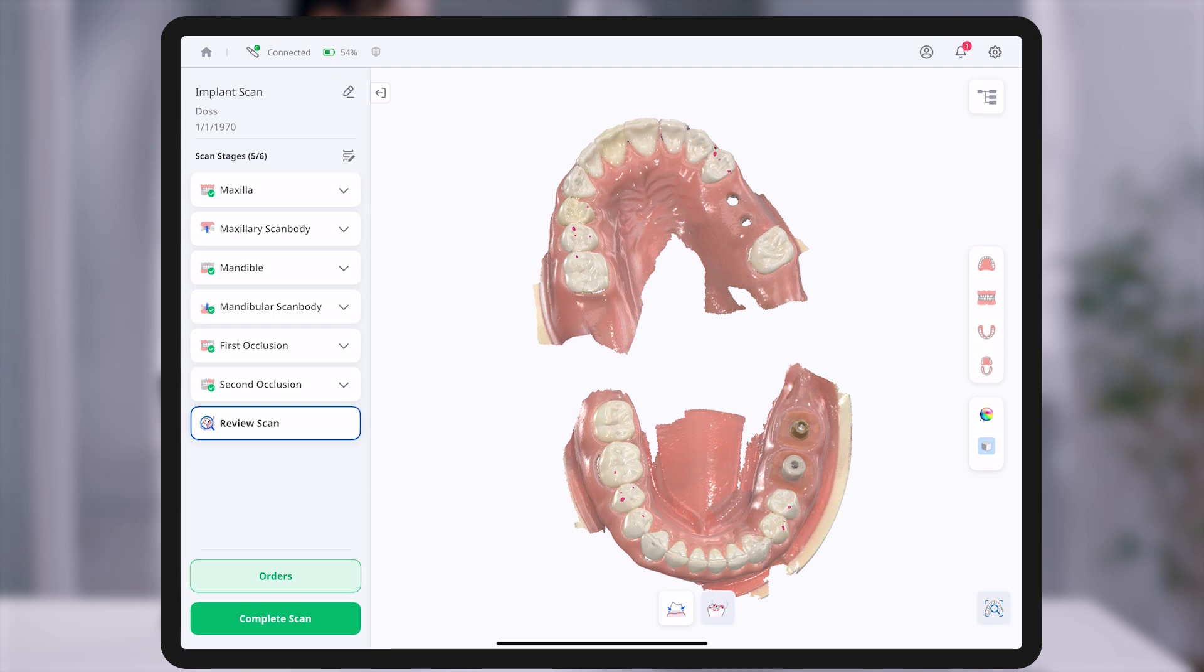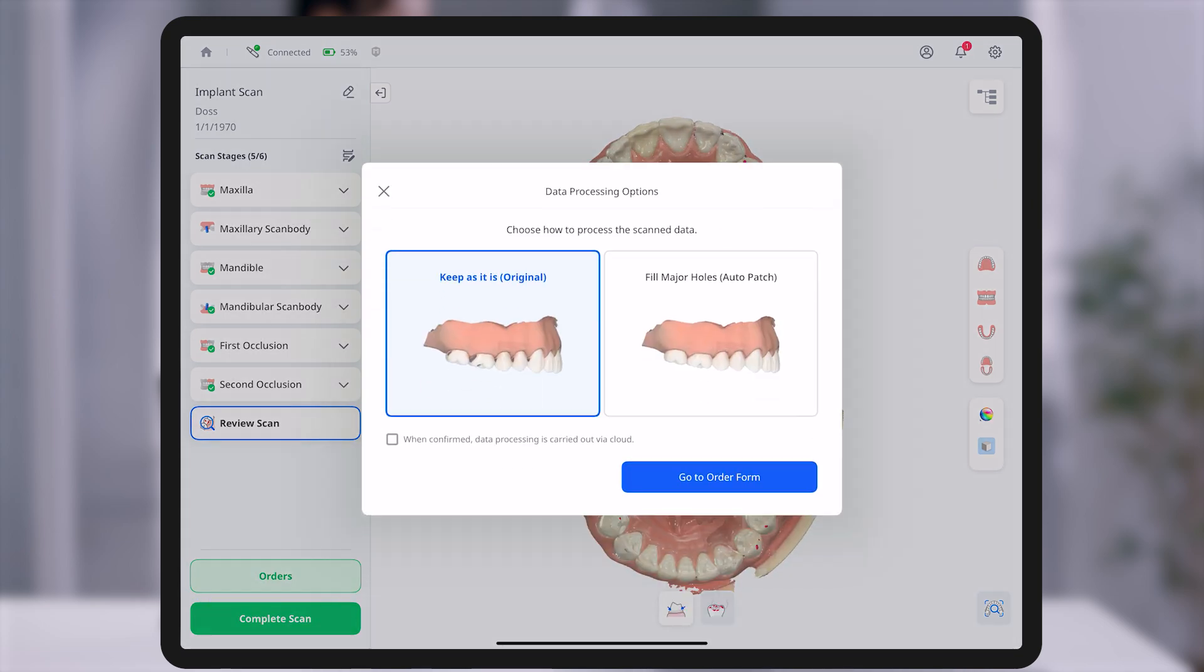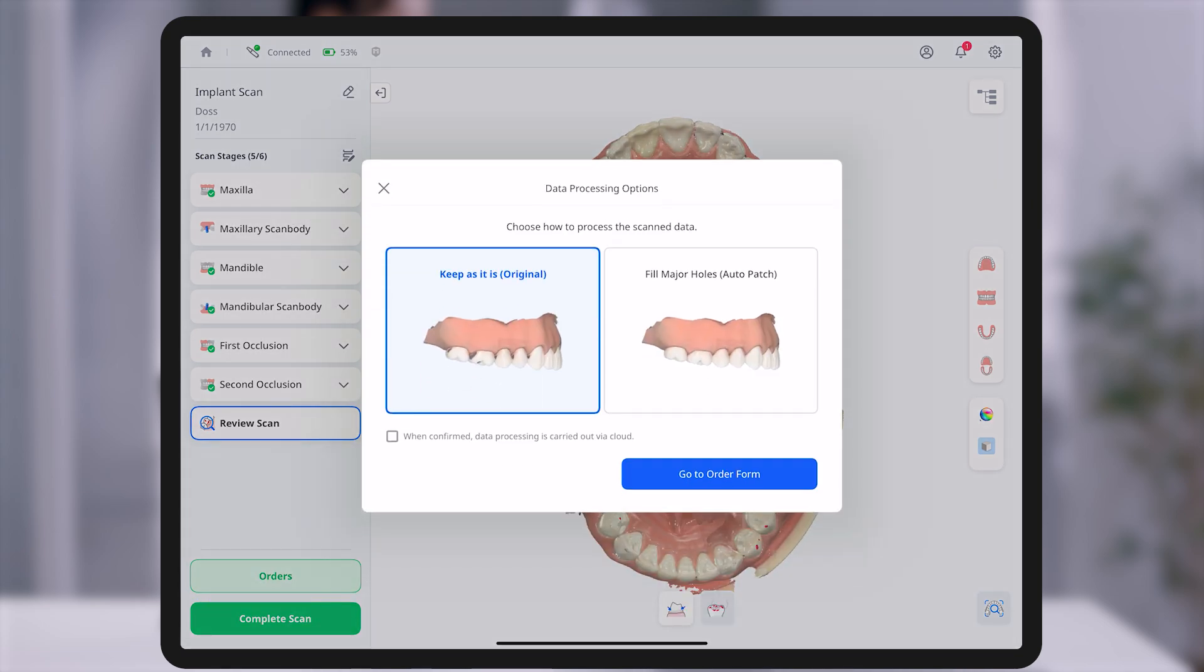Once the scan review is complete, you may proceed to the orders step. In the data processing options, you can choose between original, which preserves the scan data as is, and auto patch, which automatically fills large holes.